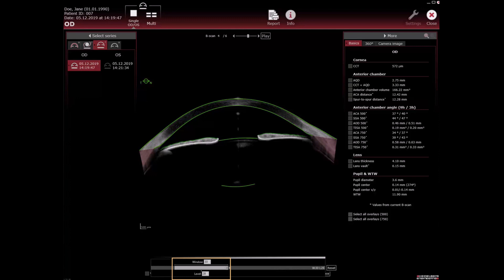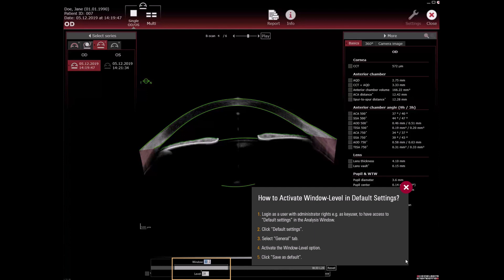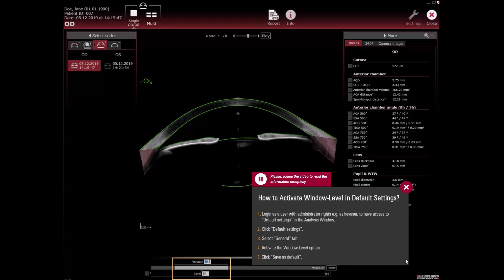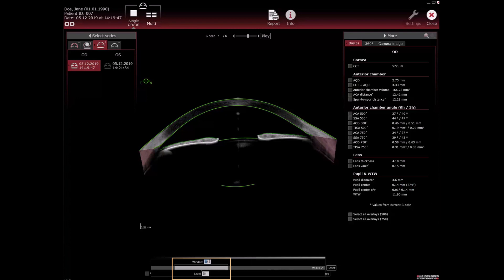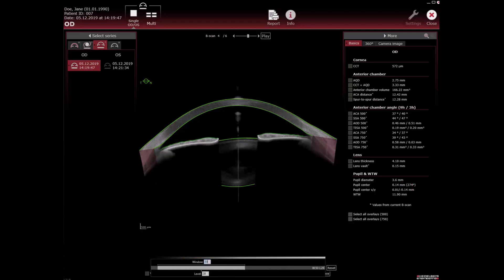You can activate window level in default settings. Click the reset button to reset the changes.